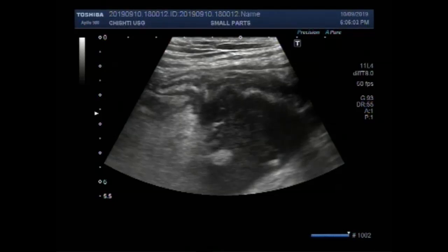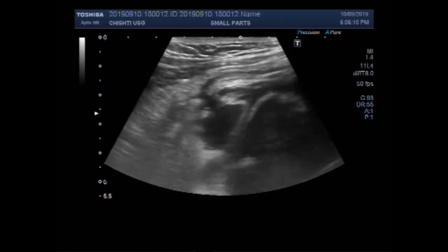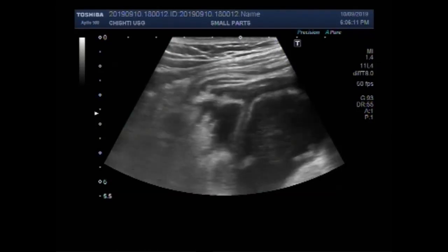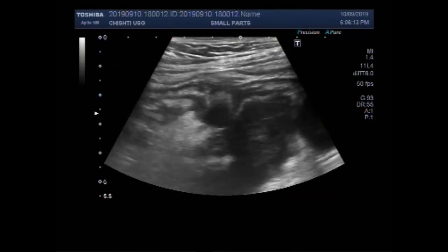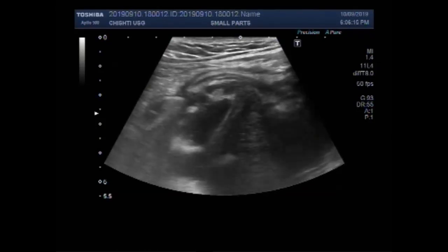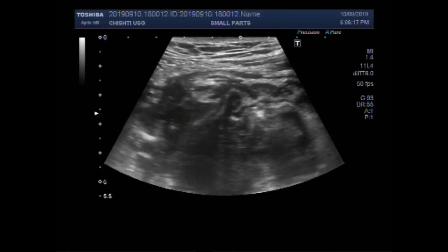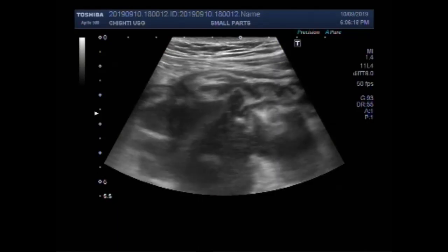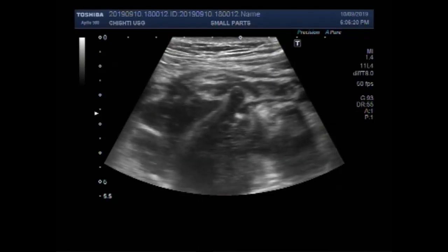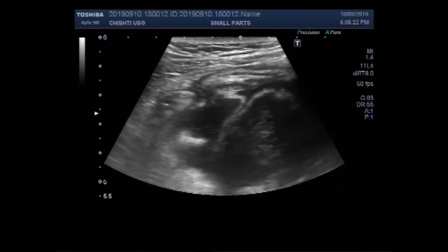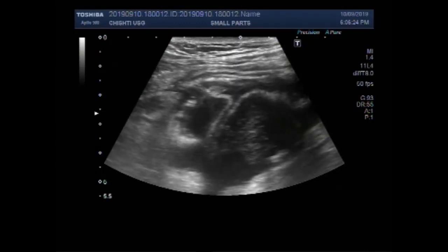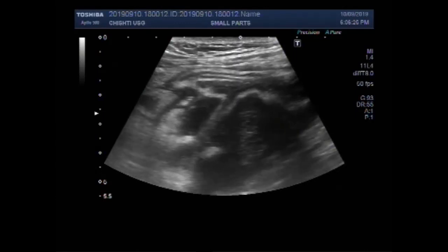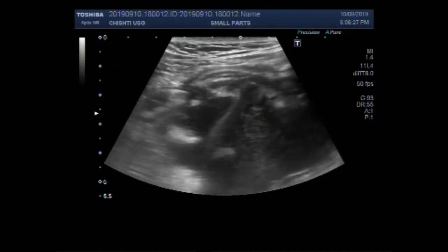Dear viewers, I hope you are all fine. This ultrasound video shows a case of leaked appendix, ruptured appendix. You can see a significant amount of inflammatory fluid in the appendicular area, in the right iliac fossa.